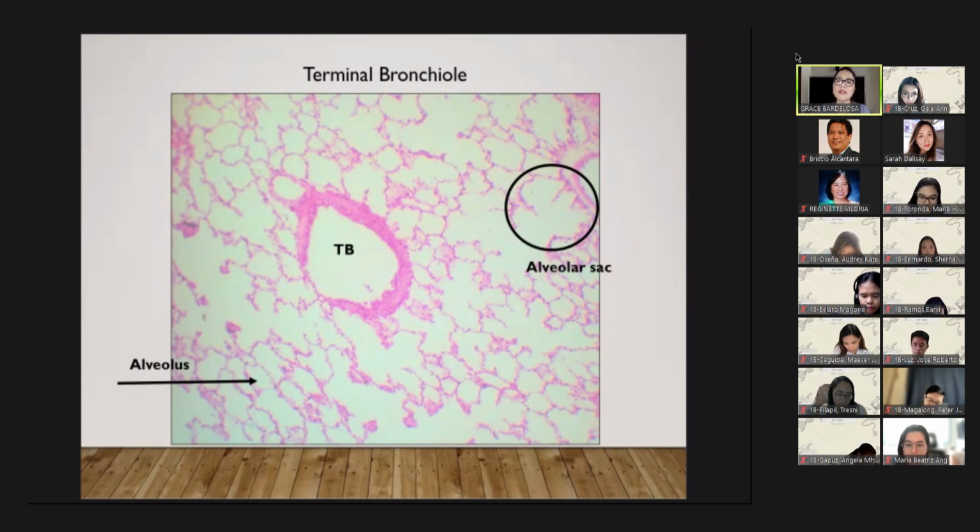Okay? So these are the non-ciliated cells with dome-shaped apical ends, and those apical ends contain secretory granules. But we cannot appreciate them. The club cells could not be seen separately here in this picture.